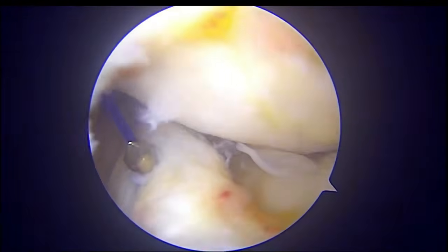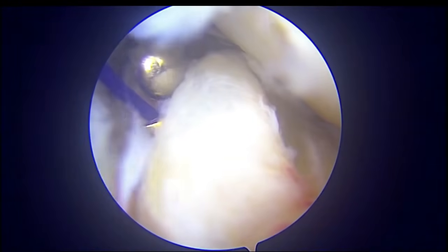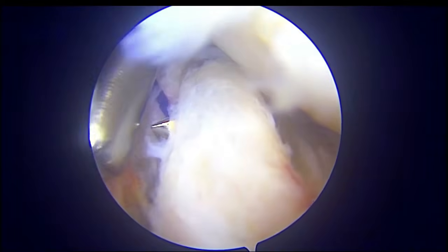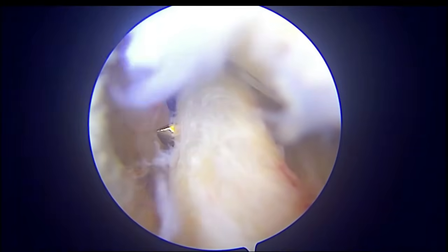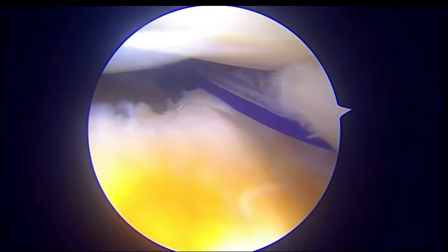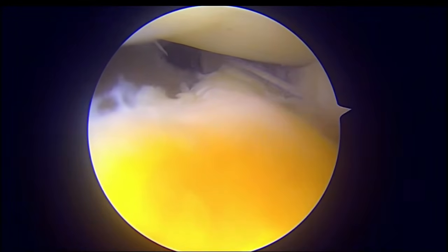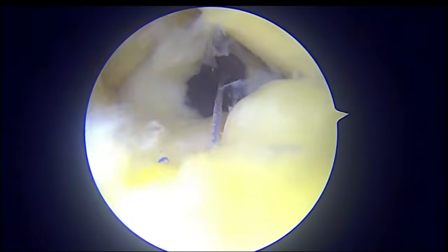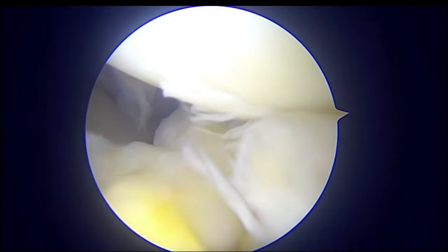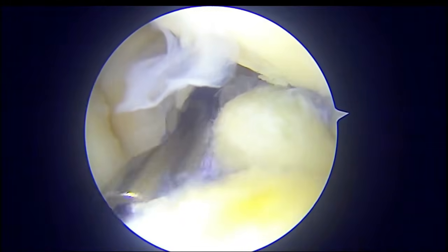And that is being used for suture shuttling and suturing. The fiber wire is coming inside. And the knots are being put. Knots again, 5 to 6 knots. And then the excess part is cut using a cutter.